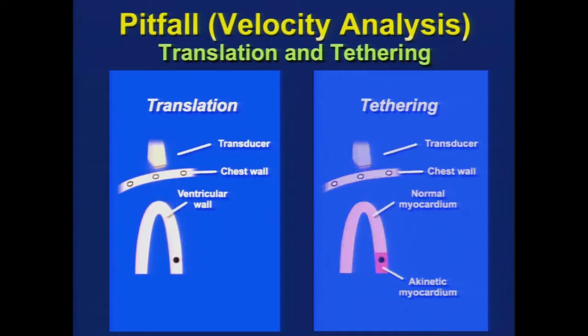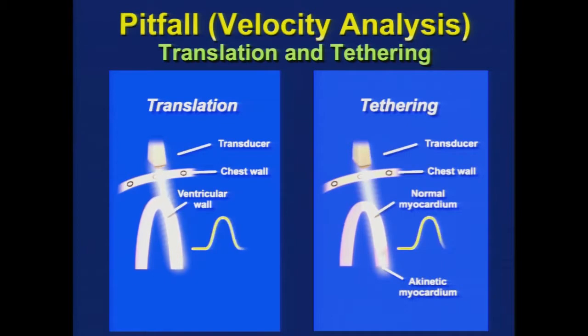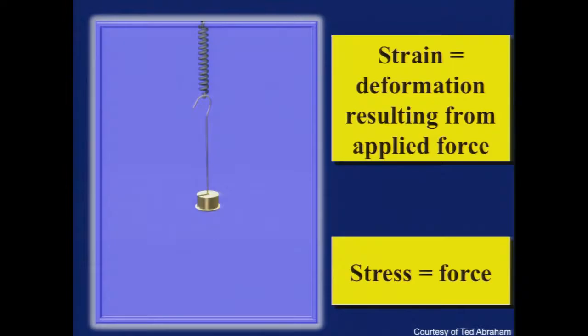There's going to be velocity associated with that motion, but it may not represent, again, true compression or contraction. So to overcome this issue of velocity analysis and the pitfalls, one may look at more local parameters of deformation, things such as strain and strain rate imaging. And strain in mechanical terms is really used to describe deformation of an object, and that is deformation that results from an applied force, this stress-strain relationship.